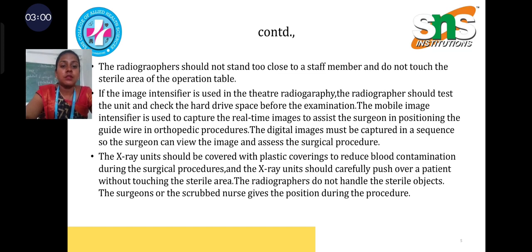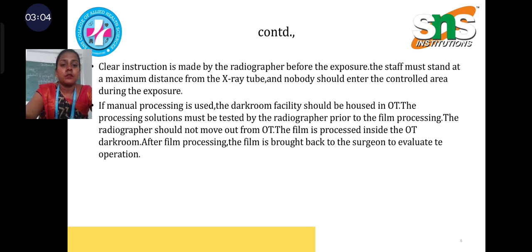The surgeons or the scrubbed nurse give the position during the procedure. Clear instruction is made by the radiographer before the exposure. The staff must stand at a maximum distance from the X-ray tube, and nobody should enter the controlled area during the exposure. If manual processing is used, the darkroom facility should be housed in the OT.